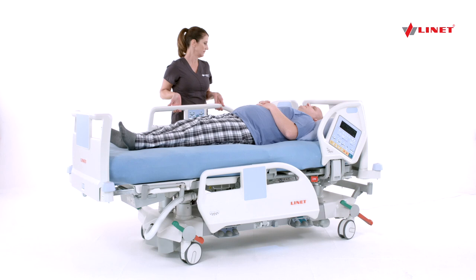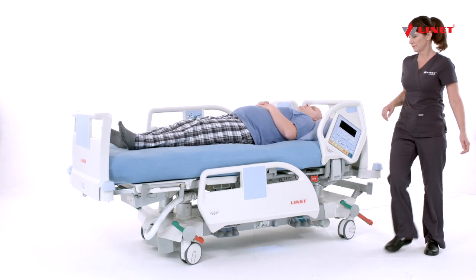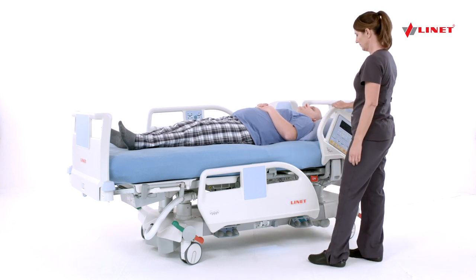To activate Turn Assist, ensure that the side rails are up to the direction that the patient is turning. As a safety feature, the bed will not turn with the rails down.